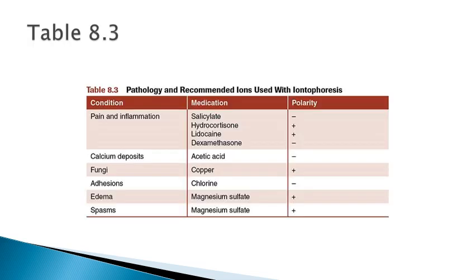So here are the common medications used with iontophoresis. Make sure you familiarize yourself with the polarity charge. You have to match the polarity to the lead. All the negatively charged ions have to go on the cathode, all the positively charged have to go on the anode, okay? Probably the most common one utilized is dexamethasone, very common to use. I'd probably say clinically I've used dexamethasone the most. That's an anti-inflammatory. Lidocaine is basically a numbing agent, so it causes an anesthetic effect.